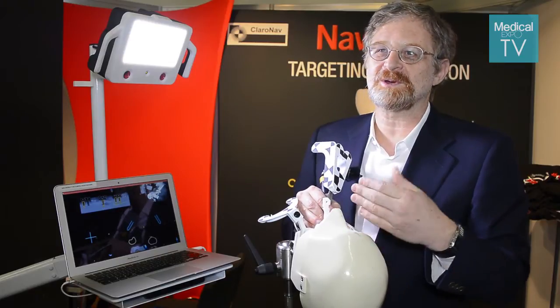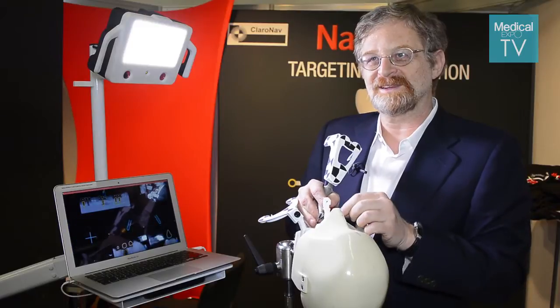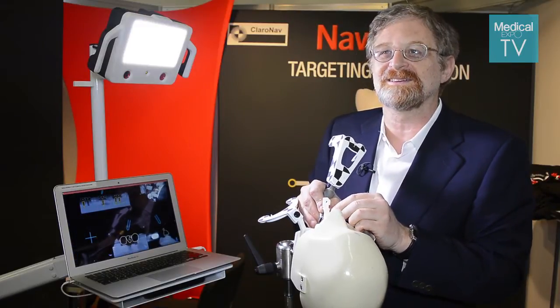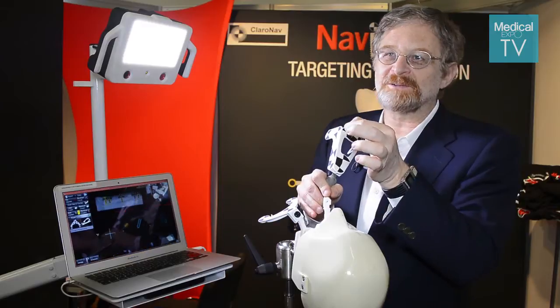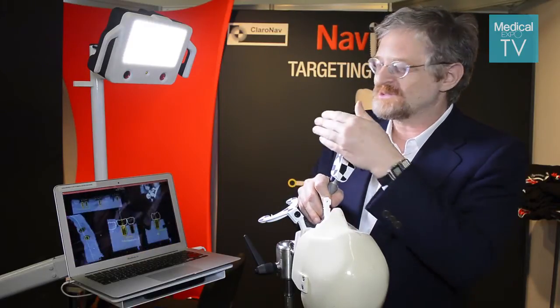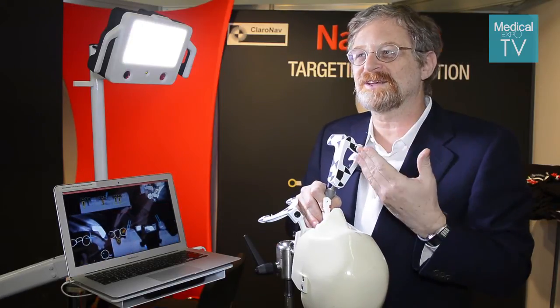It requires some training because it requires a change in the way they work. Currently they have to cut the gums, raise the gums, and then look at the bone very carefully while they drill. In our case, they just look at the screen. The screen guides them to place the tip of the drill at the entry point, then change the angle to the right angle, and then drill to the depth. So they spend most of the time looking at the screen instead of looking in the mouth, which requires some adaptation.